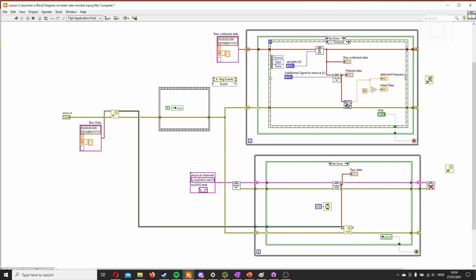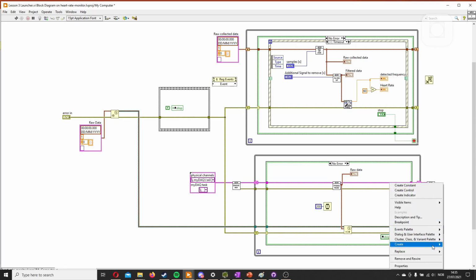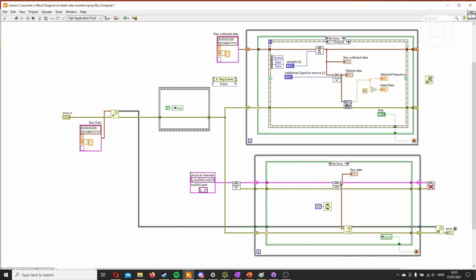We then need it to go to the close. We'll put this error in here, error here. We can also just make the error out now. So we'll just make an indicator here and call it error out acquisition. And we will also make an error out here. So we can see an error that goes here. Now when this runs, it will send the data every loop. But we still don't have a receiver.